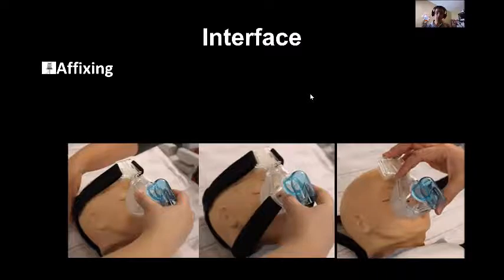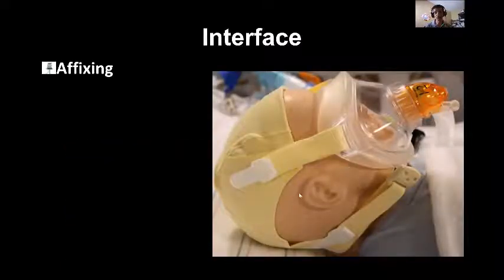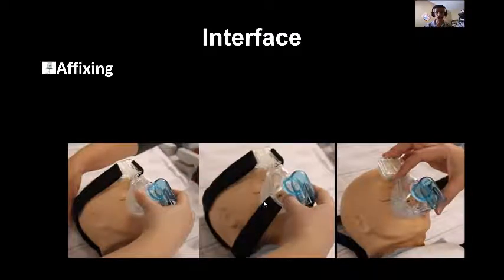By fixing the interface appropriately on, we should use 2 straps. And these straps change, it depends on the gestation. Usually in a neonate, we use a hat to connect the CPAP or the mask, and it also has 2 straps. Here you can see 2 open straps, and these straps are connected to a hat, not like the other one. It's directly on the head.